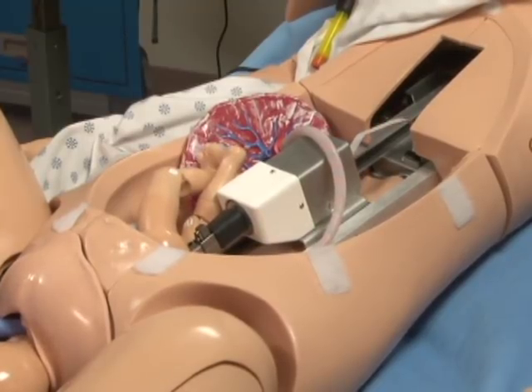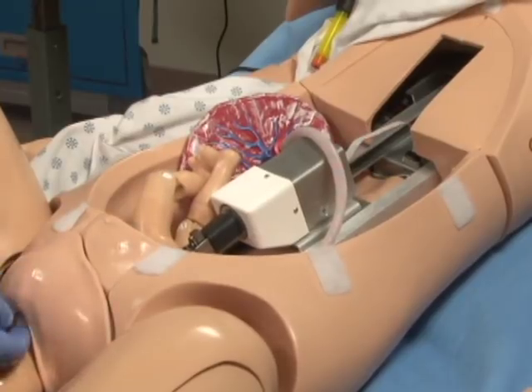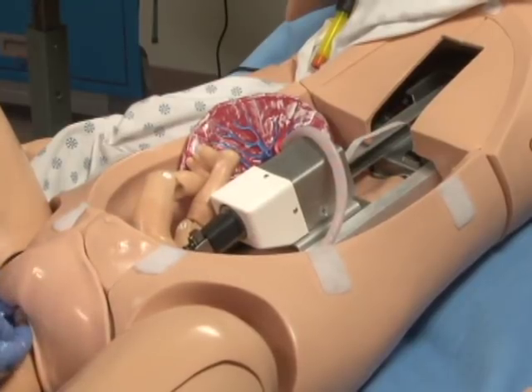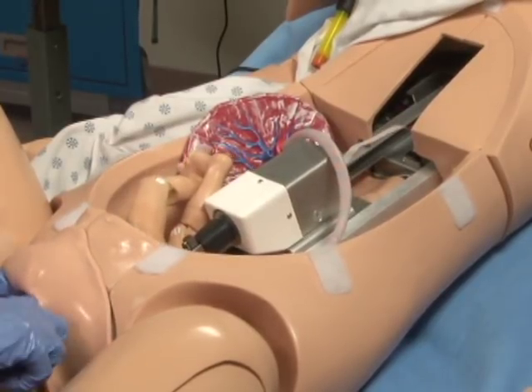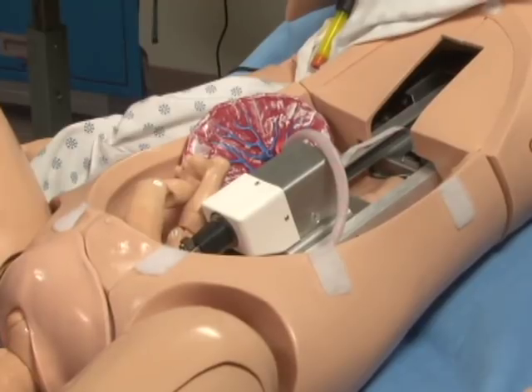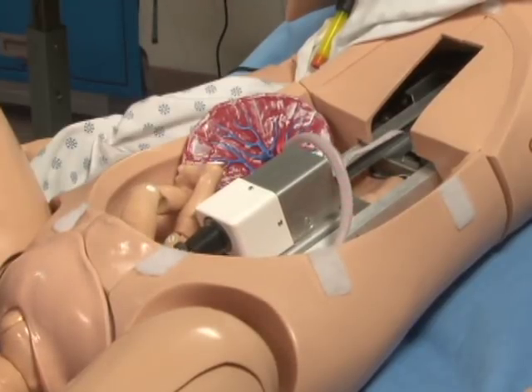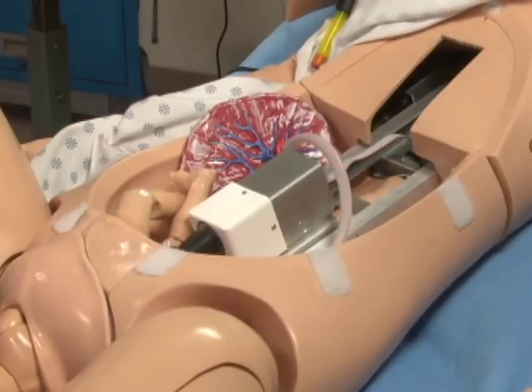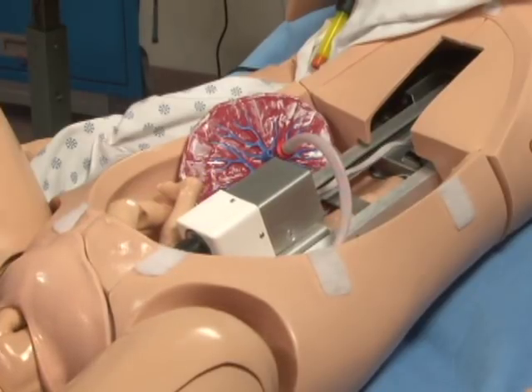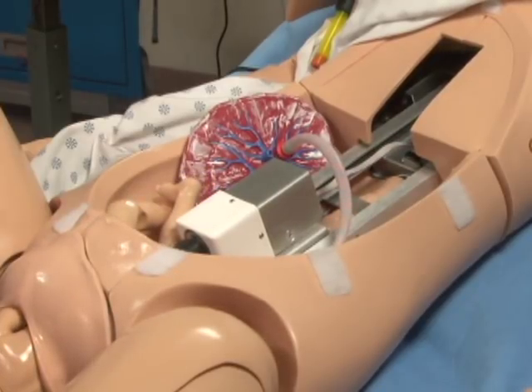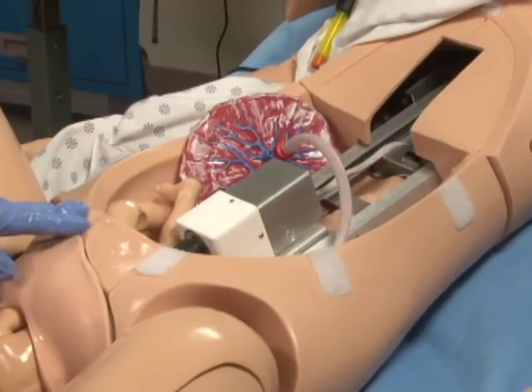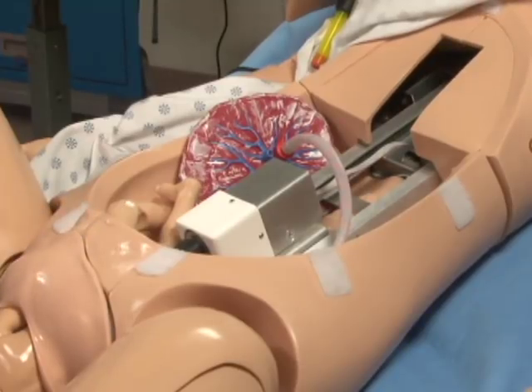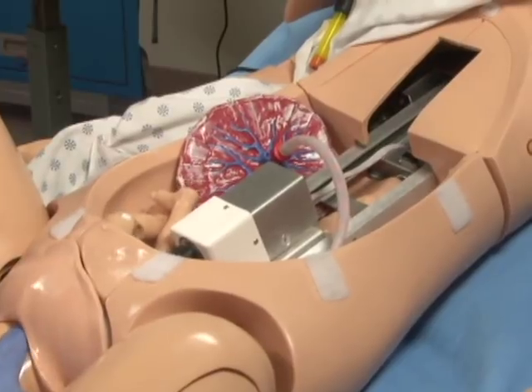As the baby delivers, it may be necessary to reduce the cervix a little. Once we complete the delivery cycle, the motor mechanism releases the baby and then it's up to the provider to deliver the baby the rest of the way.